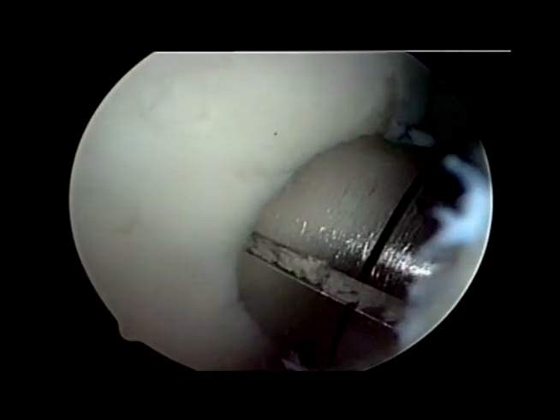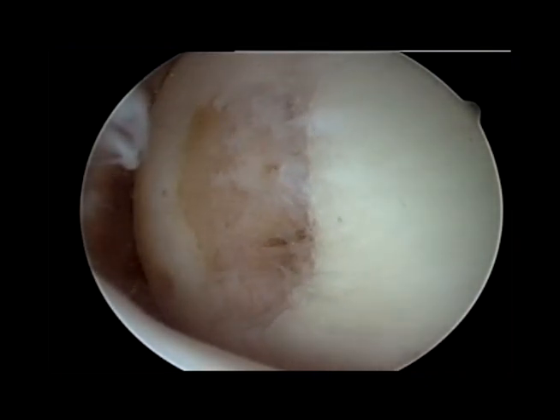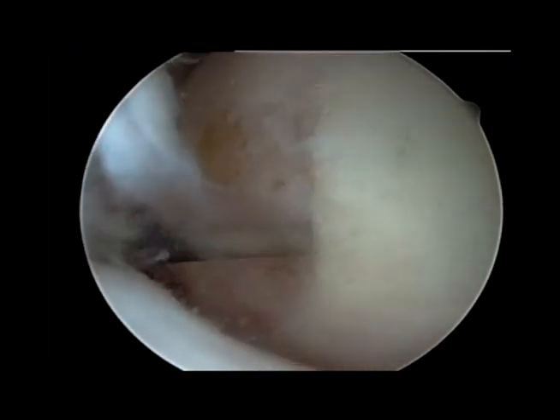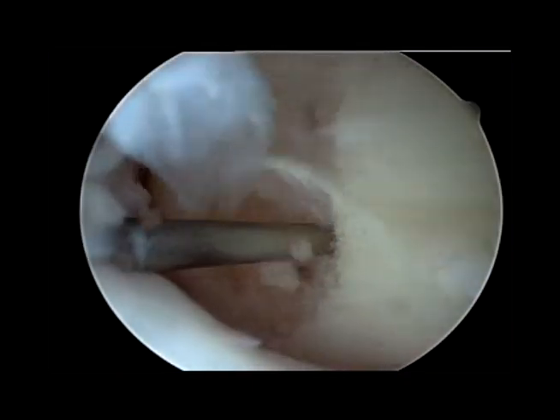The key here is being able to line up the cartilage perfectly. We're harvesting this cartilage plug with the bone and then using this needle to find exactly where we need to go to make this completely perpendicular as best as possible.